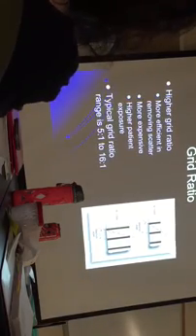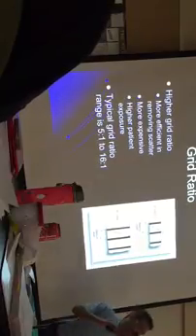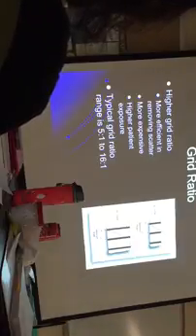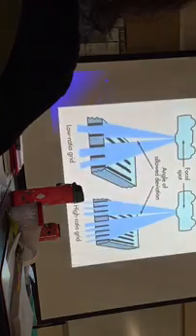All right, typical ratio grids. The range typical for diagnostic radiography, you're going to go from about 5 to about 16. 5 to 1s to 16 to 1s. The most common are probably 6 to 1s and 8 to 1s. That's what you typically see in diagnostic radiography. But the 10 to 1s, 12 to 1s are common, but not as common as 8 to 1s. And remember, once again, the higher the ratio grid, the more cleanup you have, but the higher the patient dose. Make sense? Okay, all right.